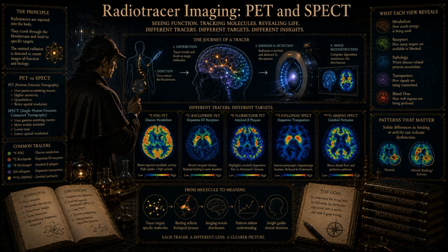In the late 90s and early 2000s, researchers were immensely interested in the D1 receptor, particularly in the prefrontal cortex. We knew the prefrontal cortex was vital for working memory, executive function, and cognition, areas where patients with schizophrenia show profound, debilitating deficits. To study this, radiochemists developed two major competing D1 radiotracers, 11C-NNC-112 and 11C-SCH-23390. And different highly respected research groups used these different tracers to scan cohorts of patients with schizophrenia.